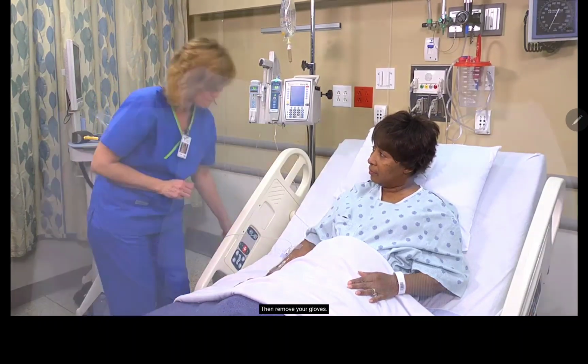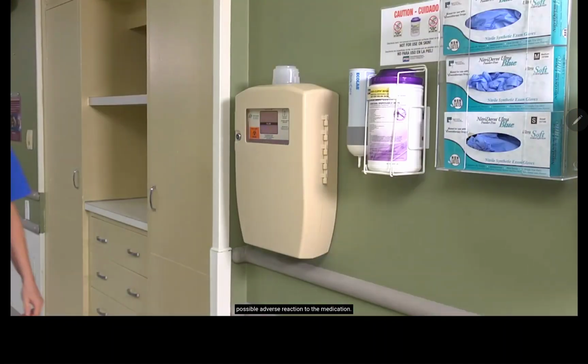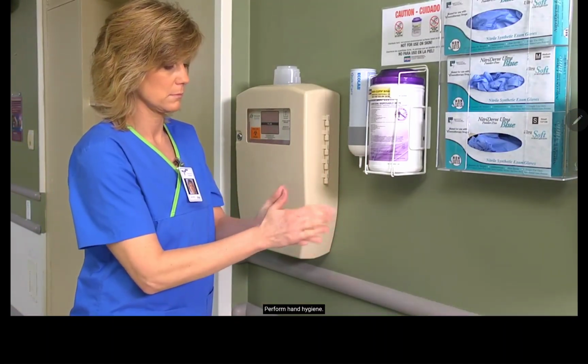Okay. Stay with the patient for the first few minutes of the infusion to assess for a possible adverse reaction to the medication. Perform hand hygiene. Document the time at which you initiated the infusion.